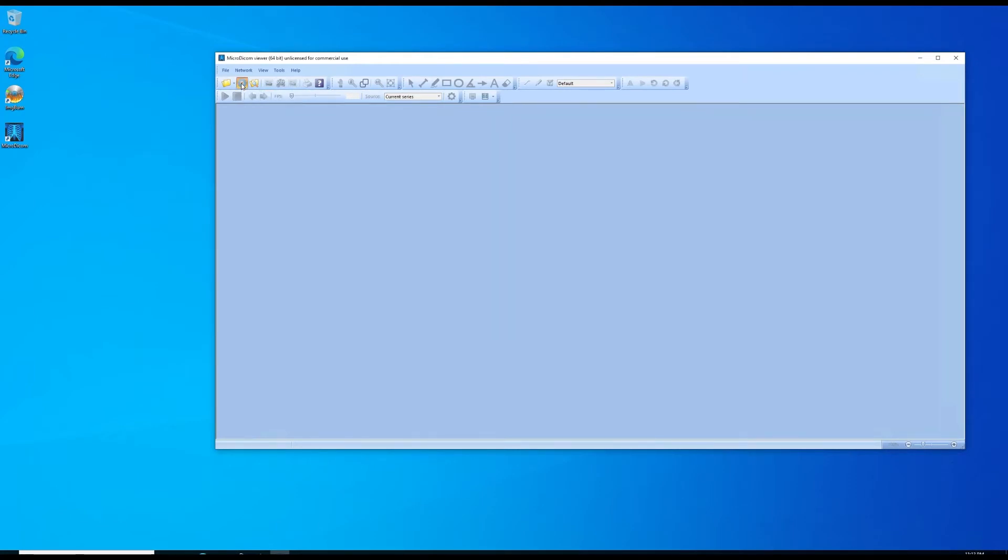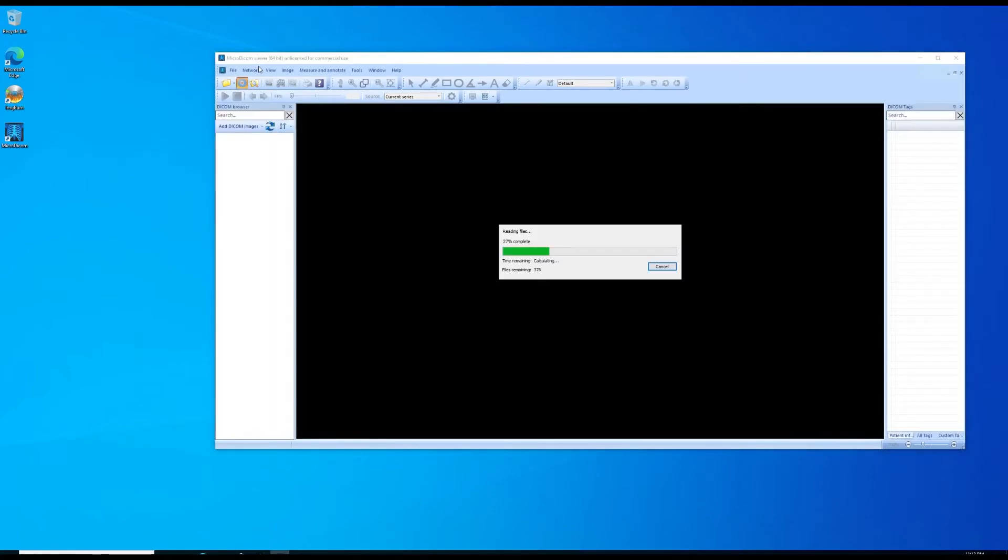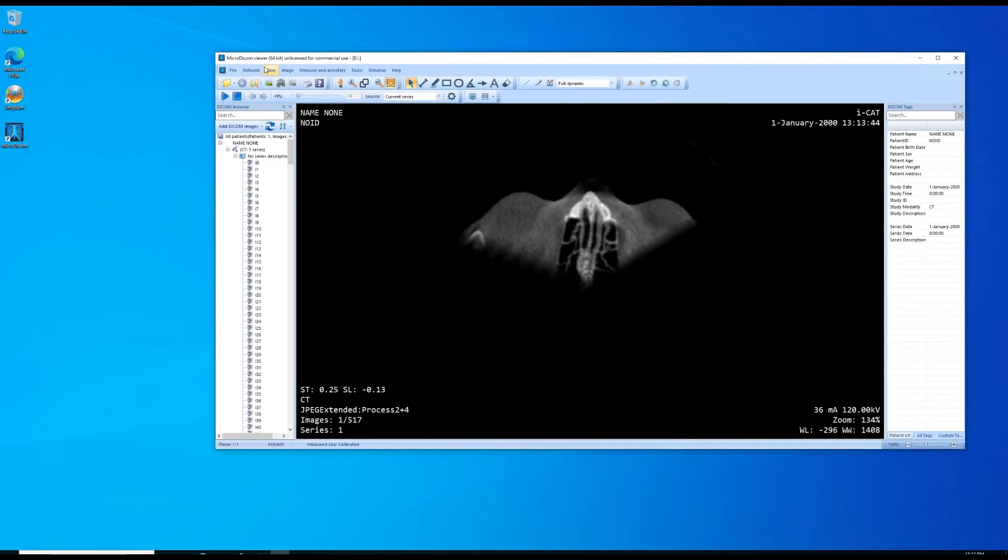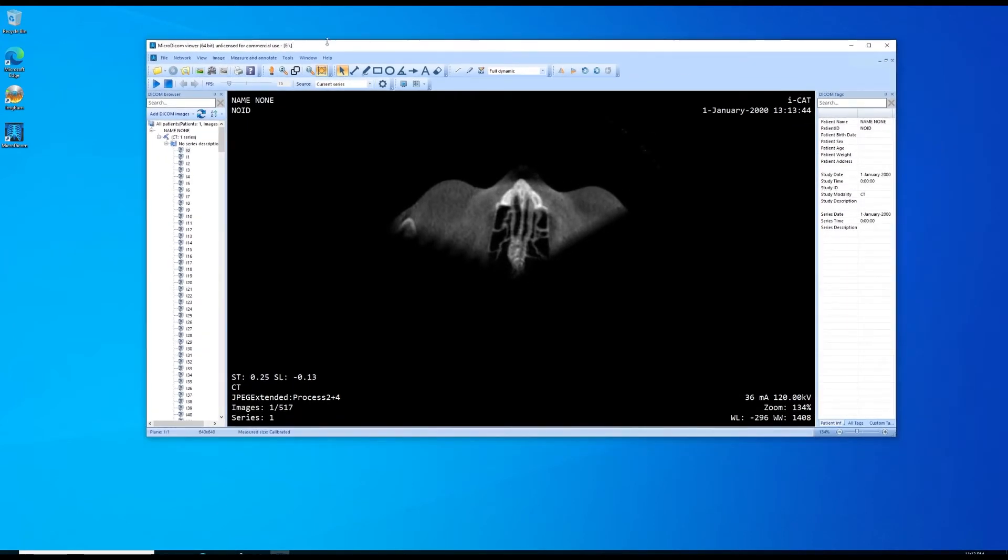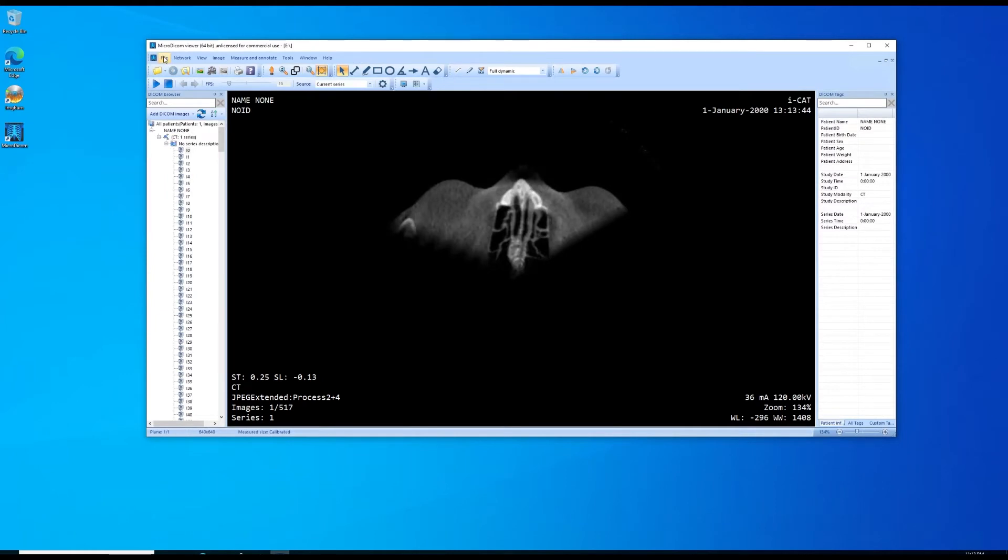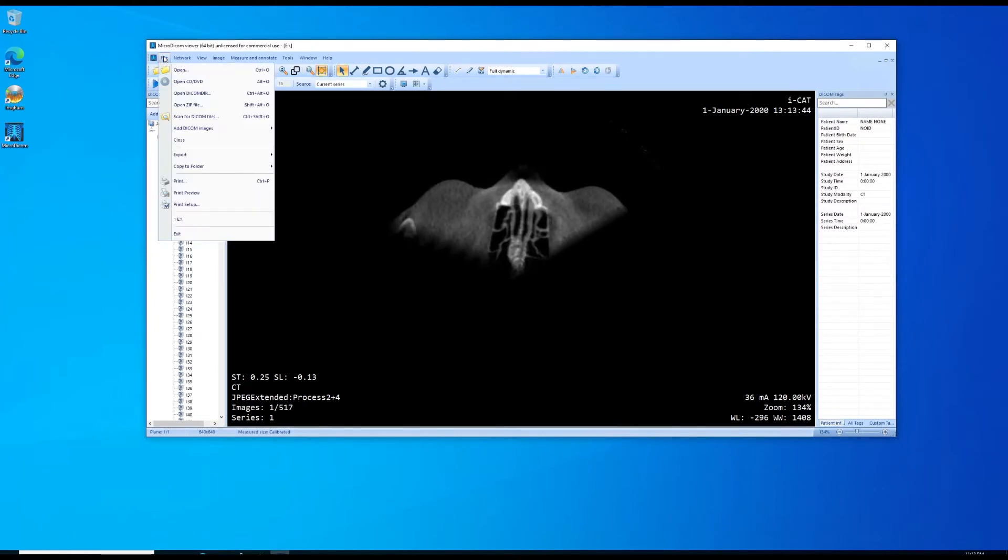Now in MicroDICOM I'm just going to click the icon of the disk. It'll automatically look for a CD and load the DICOM images. If you're doing this from a CD it's going to take much longer. The read time from a CD takes the program a lot longer to load.